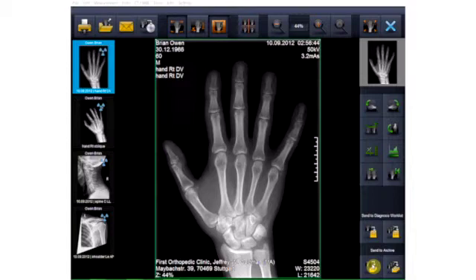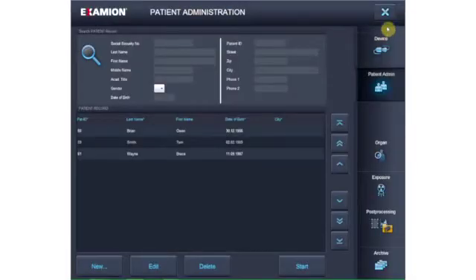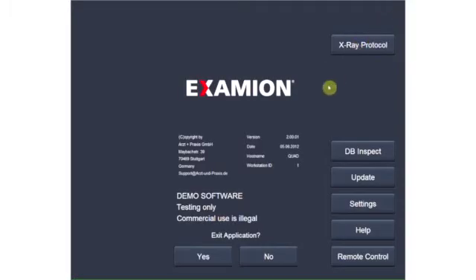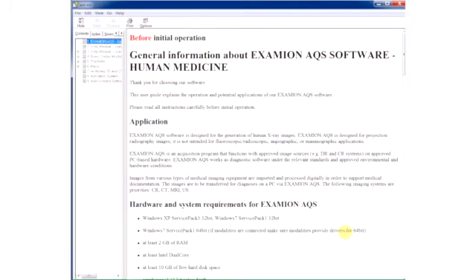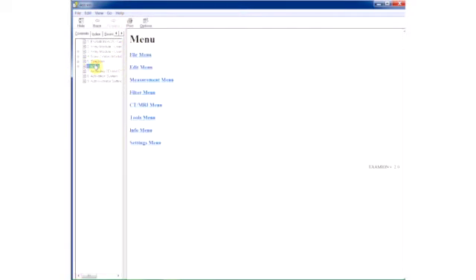Naturally, the image can be saved in the archive immediately or at any other point in time. To exit the Examion AQS software, simply click the X button and confirm the question to end the program with Yes. You can access the online help for the Examion AQS software from this screen. It supports you when you have questions and allows you to deepen and broaden your knowledge of the software.